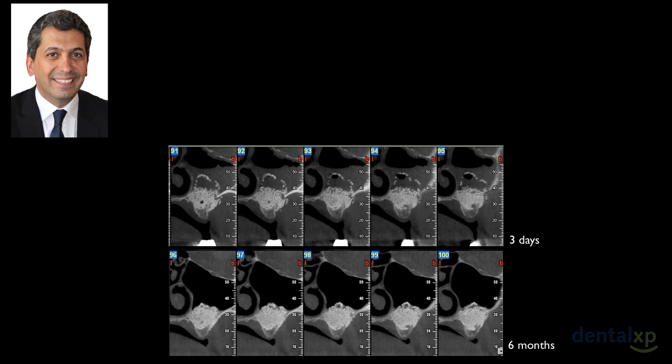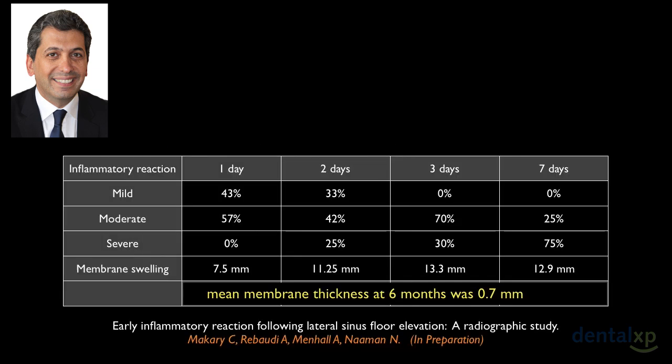This is another case. You see at 3 days how we had this hemorrhagic release of fluids inside the graft, and you see how the graft did not go into the sinus because it's still encapsulated by the membrane. This is a very nice and interesting radiographic image to see. And you see at 6 months, everything returned to normal.